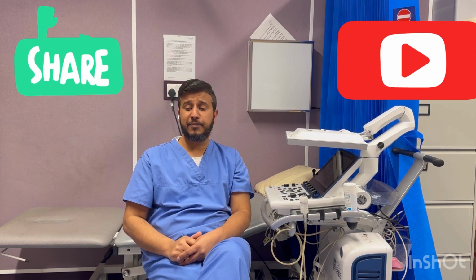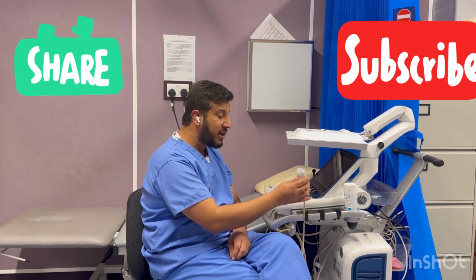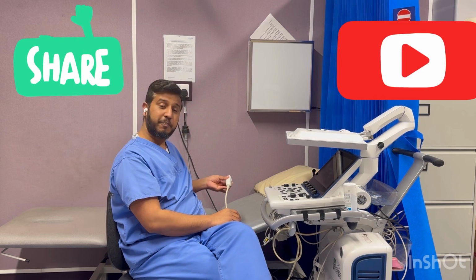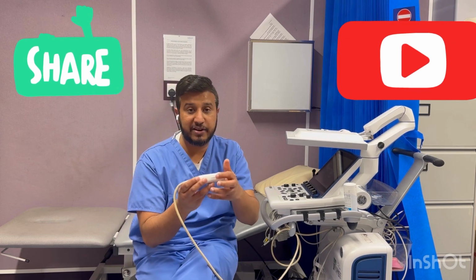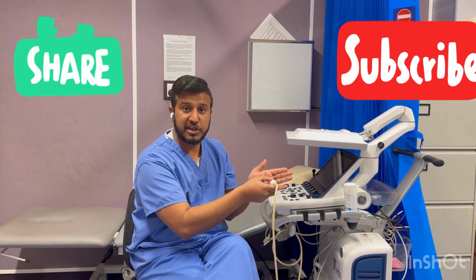Let's go on to our next window, which will be the apical window. So in the apical window, your marker will be around 3 o'clock. Okay, so you will keep your probe like this. This is my marker here. For example, this is the patient, so I'll keep the probe this way.